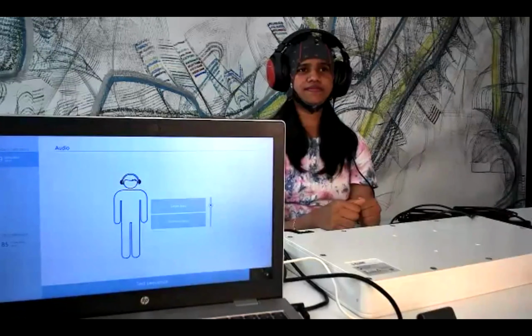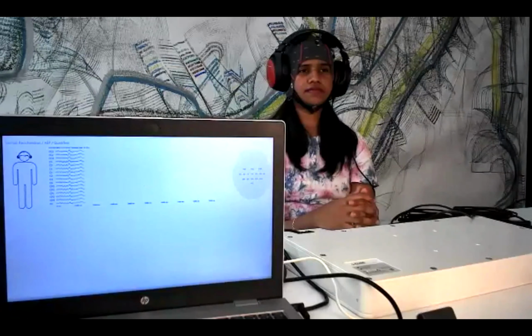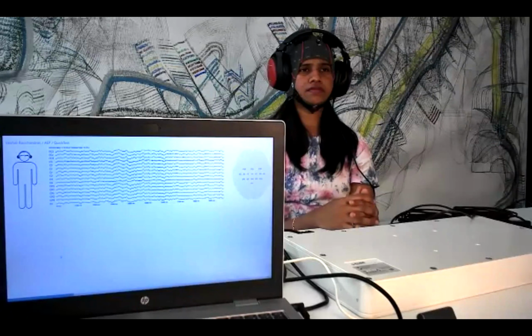Are you ready? Okay, so I will start with this one. Ready? And let's go. Here we have the progress bar. If the EPs are classified correctly, we will see a moving bar at the bottom. So now it starts moving from the left towards the right.